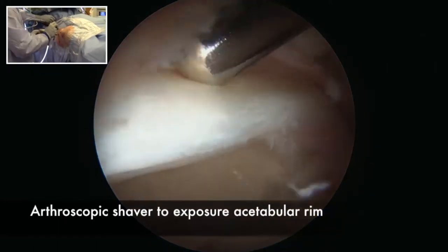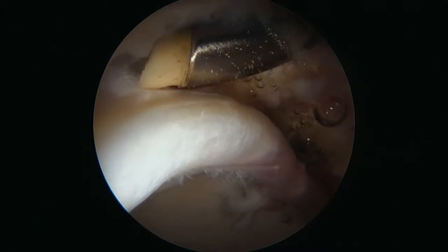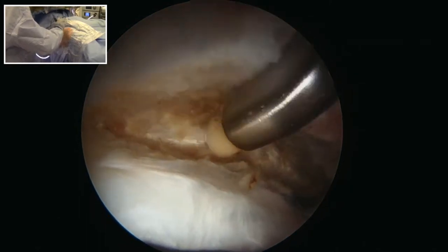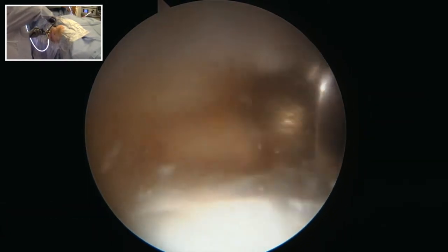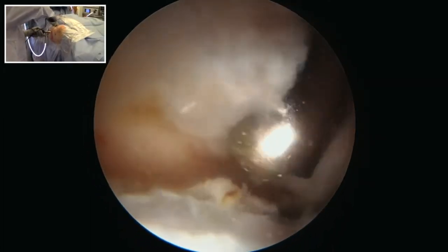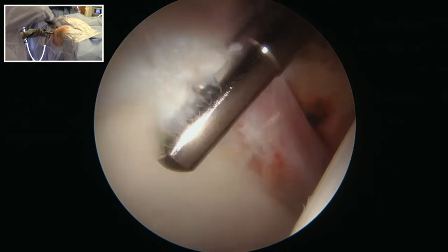A shaver is used to expose the acetabular rim, removing some capsule so we may see the labrum, then using an RF device to expose the acetabular rim. Capsular management is critical and it's important to save as much capsule as possible for later closure. A high-speed burr is used to perform an acetabuloplasty, recessing the rim behind the labrum to remove any pincer-type impingement mechanism. It's important to create a smooth rim with good transitions both anteriorly and posteriorly.